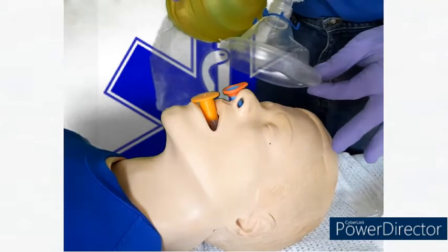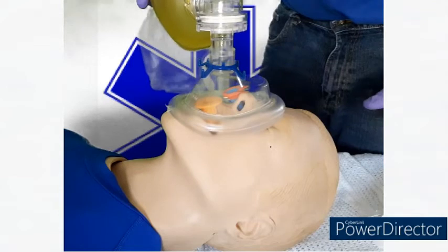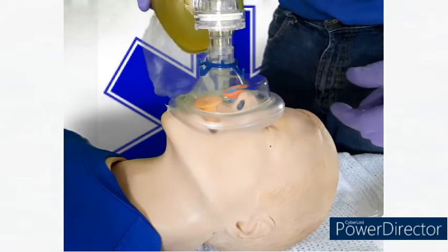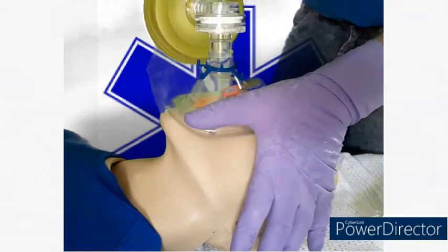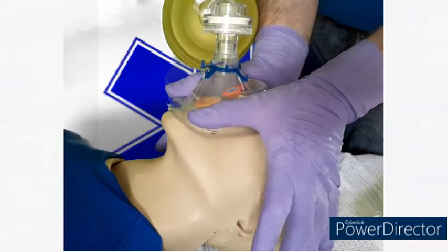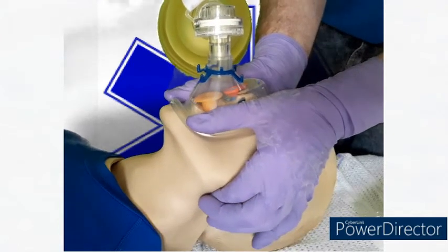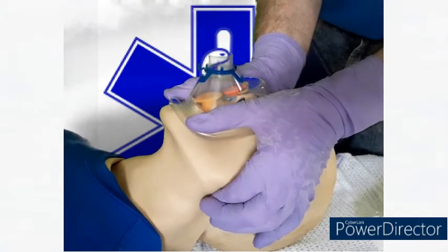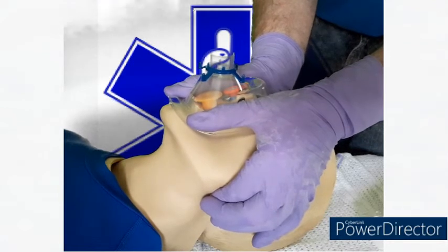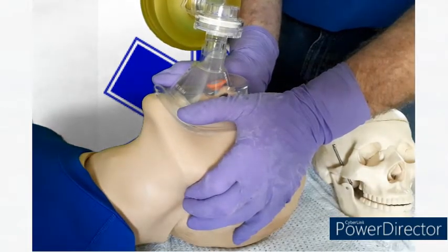To use our bag valve and mask, we place the mask over the mouth and nose with the adjuncts in place. We use our two thumbs on the mask, so our thumbs pointing to the patient's toes and our index fingers under the angle of the jaw to do a jaw thrust into the mask and hold that in place. So the two-person technique is the gold standard.